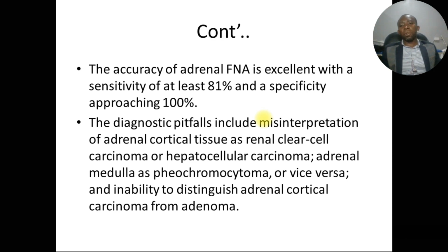The diagnostic pitfalls include misinterpretation of adrenal cortical tissue as renal clear cell carcinoma or hepatocellular carcinoma, adrenal medulla as a pheochromocytoma or vice versa, and inability to distinguish adrenal cortical carcinoma from adenoma.